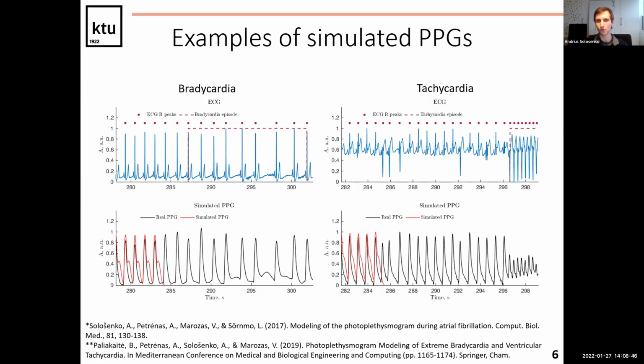And our recent work was about the detection of tachycardia and bradycardia, and my colleague fine-tuned that simulator to better represent the differences in amplitude in those cases. So you can see an example of bradycardia and tachycardia, both the real ones and simulated signals.